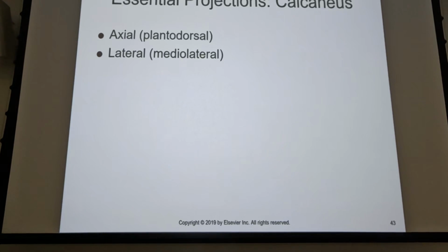We're going to skip over all the obliques, and we're going to go to page 314. So if you read through positioning of the part, really we've got a lot of the same steps that we had for the lateral foot.